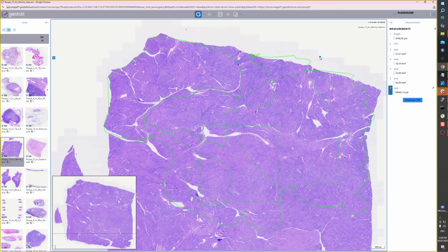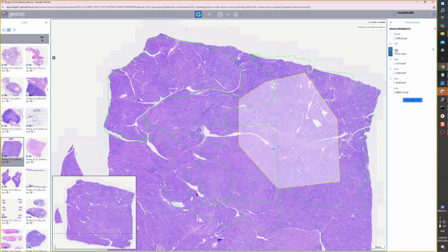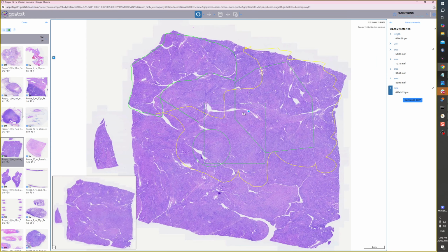Now if you want to go to any of those annotations, just click on the annotation in the sidebar, which you will have labelled in ways that probably are meaningful, but it'll take you to each individual one so you know where they are. There's that LVSI here. It'll appear in yellow, and the rest will remain green, so you can pick out any of the annotations by clicking them here. When you want to get rid of them, just hover the arrow over the number and click X, and they disappear.